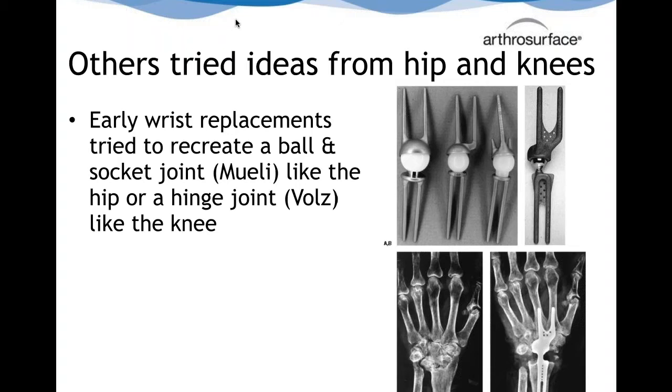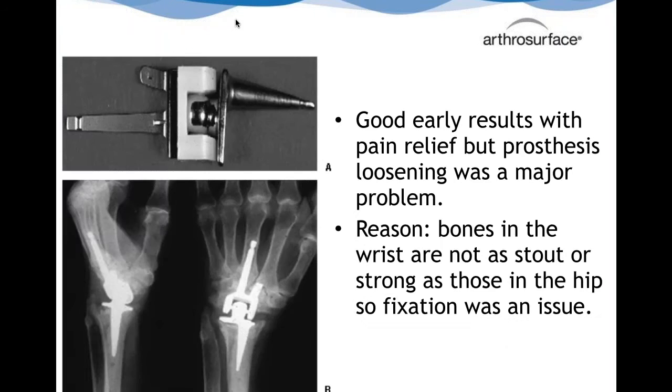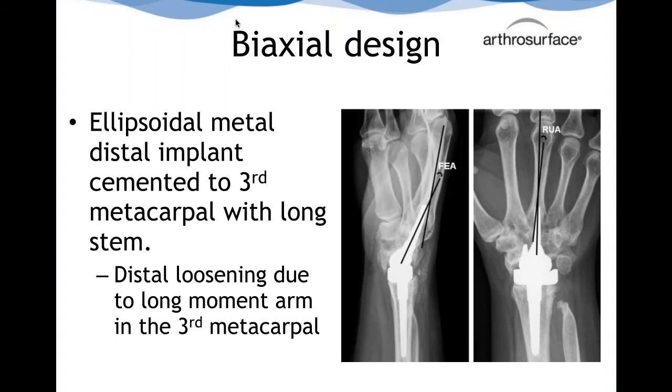It's just that there were a lot of forces on these prostheses, and they ended up failing. Good early results, but again, major problems with loosening. And I think one of the major reasons that they concluded was that bones in the wrist are not as stout or strong as those in the hips, so fixation became an issue. Fixation seemed to be more of an issue in the distal aspect, or in the hand portion, rather than the radius.